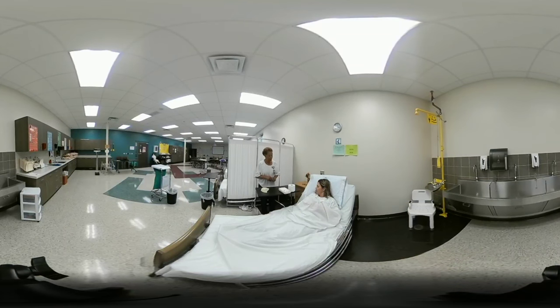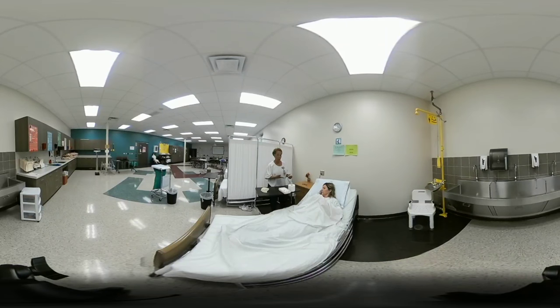Step behind the privacy screen or curtain. When the client signals she is ready, return and lower the head of bed before removing the bedpan. The head of bed should be lowered both when placing and when removing the bedpan.